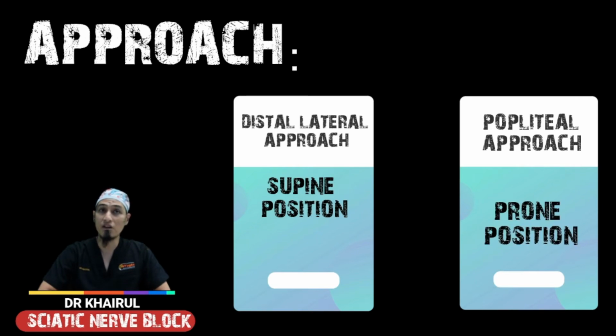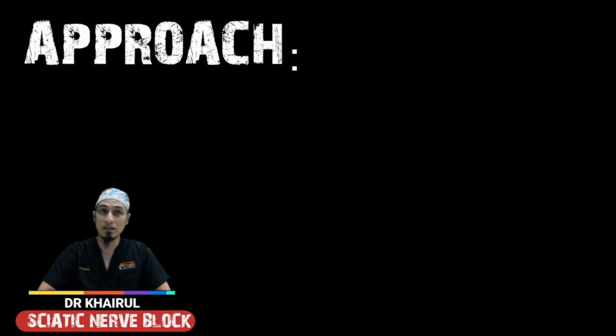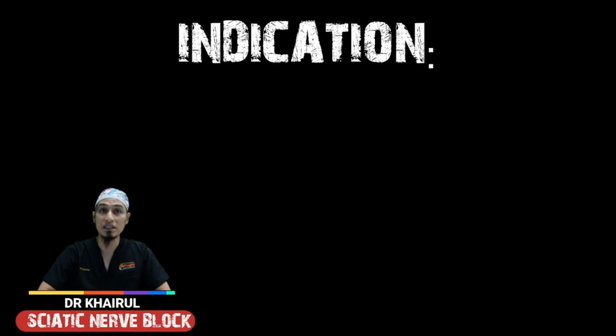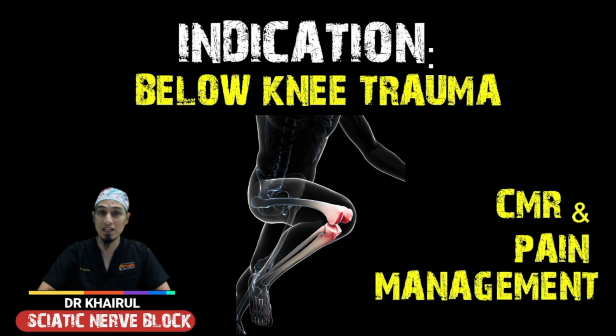Distal lateral approach is done in supine position, whereas popliteal approach is done in prone position. Distal lateral technique offers the benefit of better needle visualization and obviates the need for the patient to be prone for block performance. However, in this webinar, we will be using the term popliteal approach to refer to distal lateral, as this term is commonly used and to avoid confusion. The indications of sciatic nerve block in ED are for below knee traumas, either for CMRs or pain management. So now, let's see the technique for popliteal approach to sciatic nerve block.